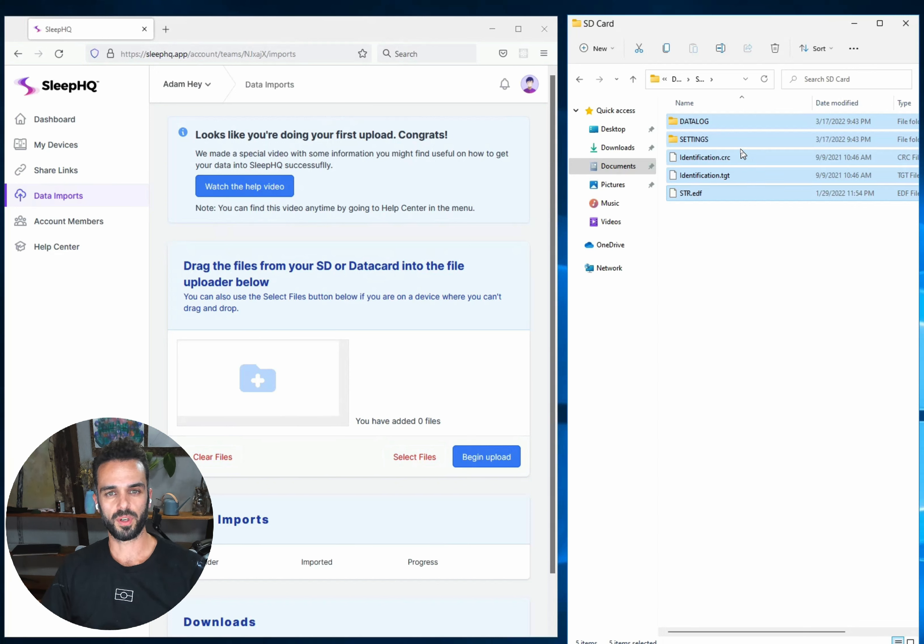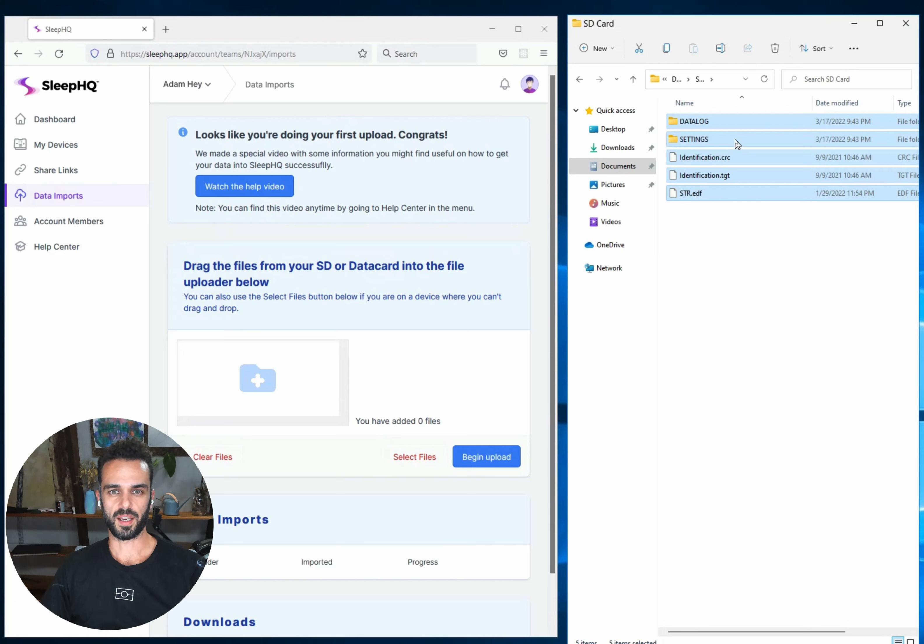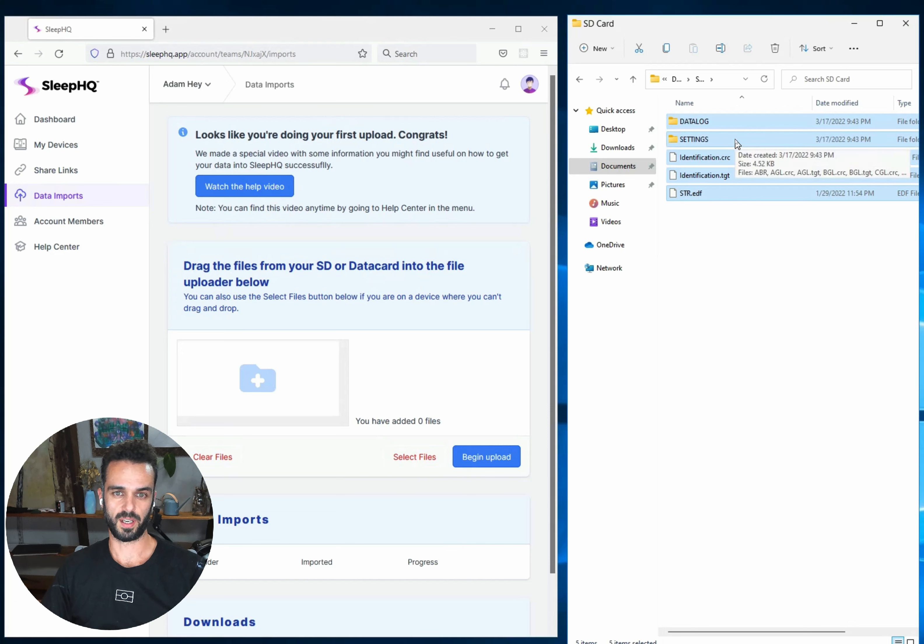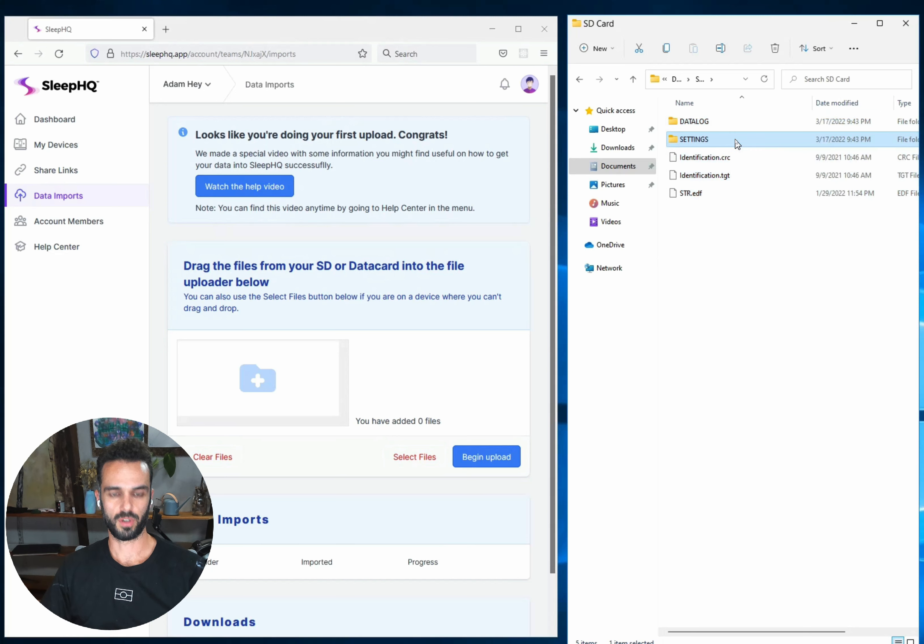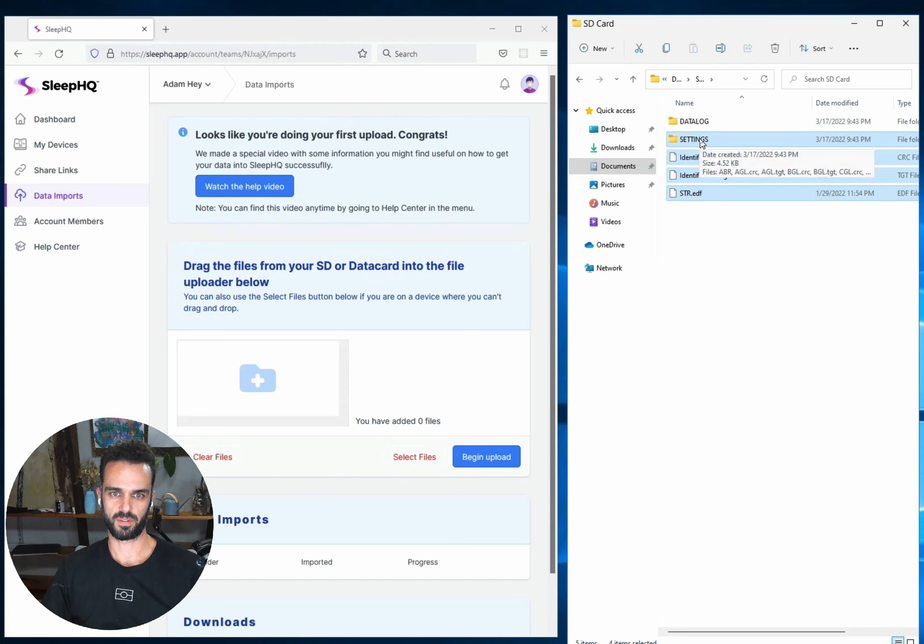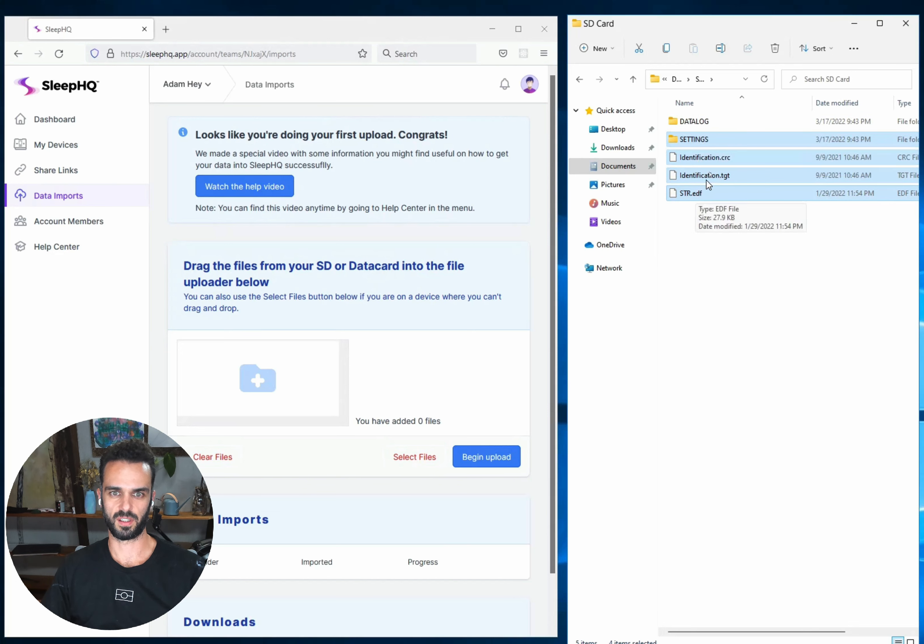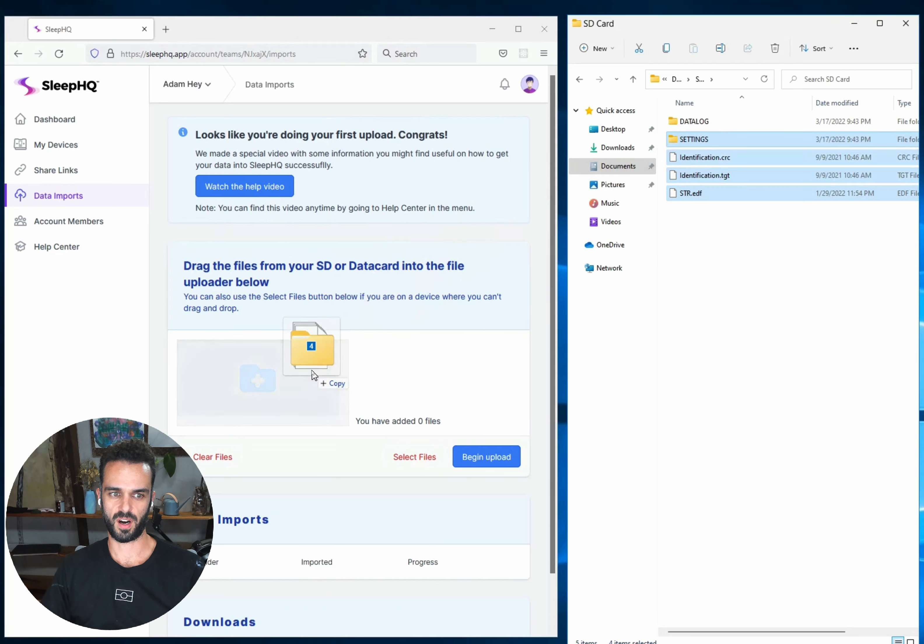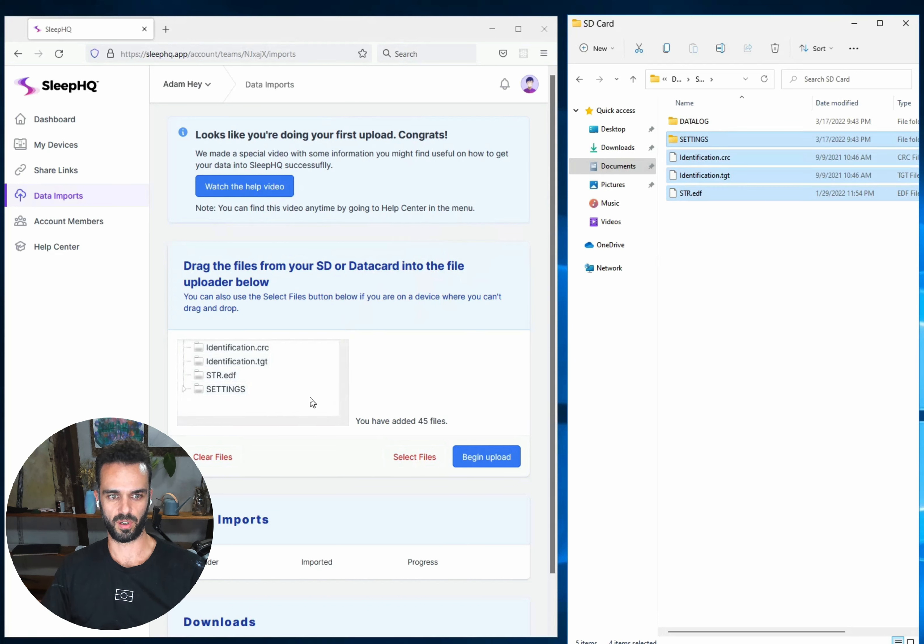Now if you've got more than about 6 months worth of data on your SD card it may be too much to upload in one go so you're going to want to upload it in chunks. So if that's you, what you're going to want to do is select everything on your SD card that is not the Datalog folder. So I've clicked on settings, held down shift and clicked on the bottom one and I'm now going to drag just those files and folders across into my upload window. And you can see I've now added 45 files.